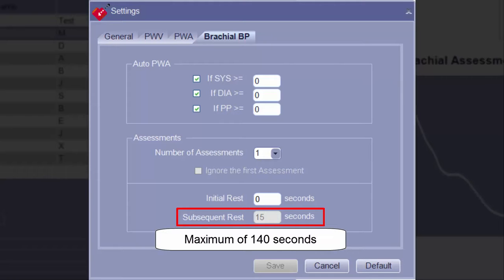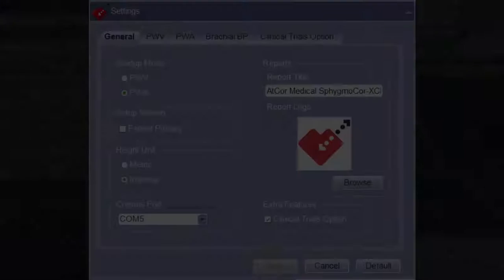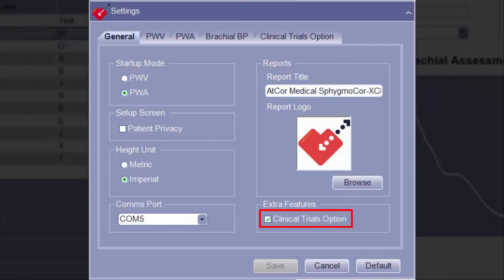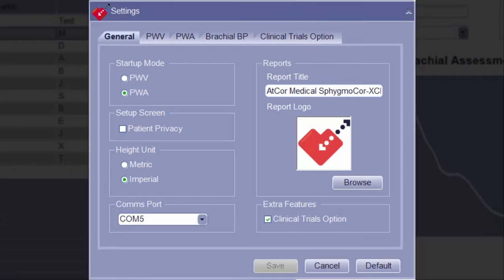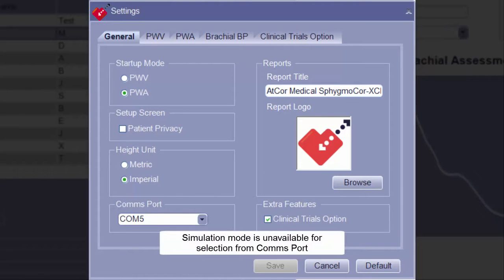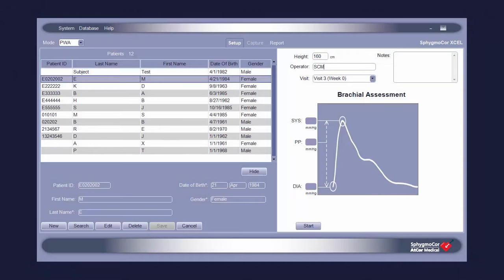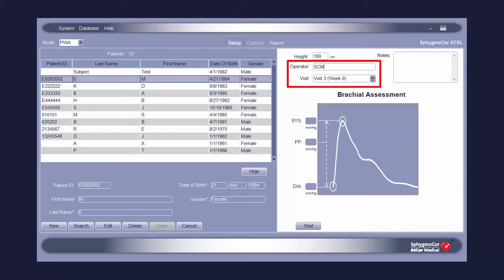The Subsequent Rest field can be set to a maximum of 140 seconds. If the Clinical Trials option is enabled in the General Settings tab, a new tab will appear at the top of the Settings window. Please note that while the Clinical Trials option is enabled, simulation mode will automatically be disabled. Another feature of the Clinical Trials option is the addition of both an Operator and a Visit field on the setup screen for both pulse wave analysis and pulse wave velocity. The Operator field allows for free text entry of an operator name or initials, and the Visit field allows for additional time point tracking through a visit identifier.